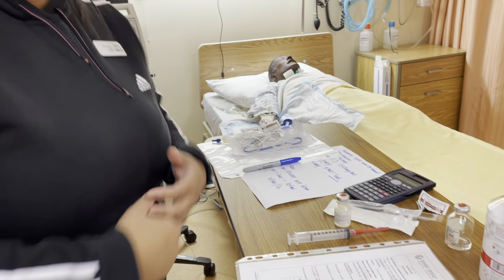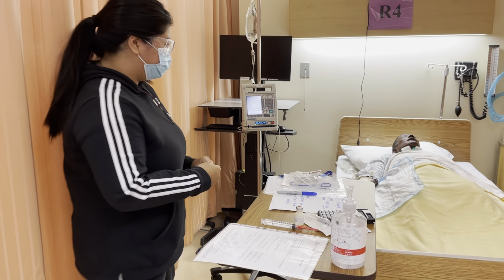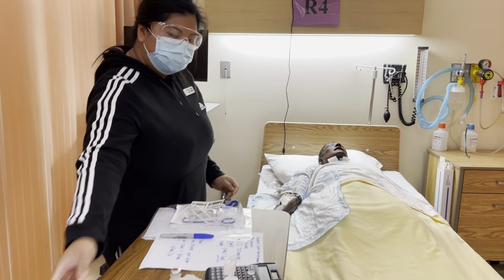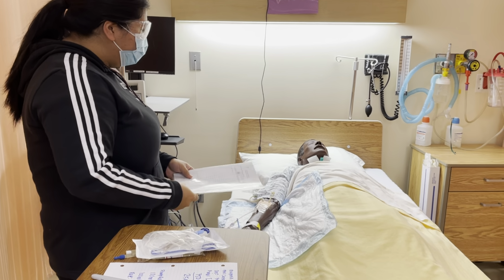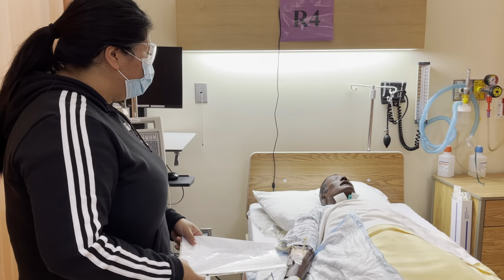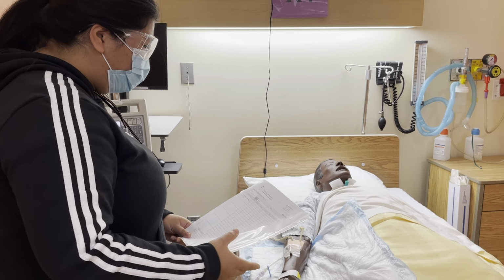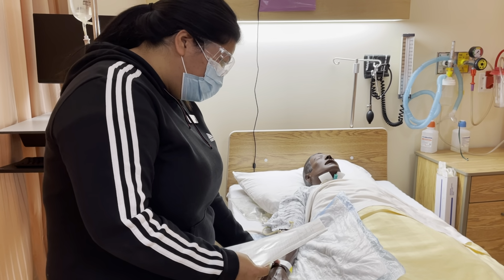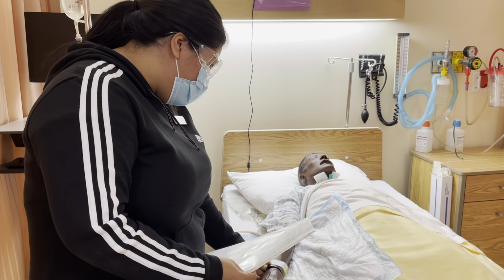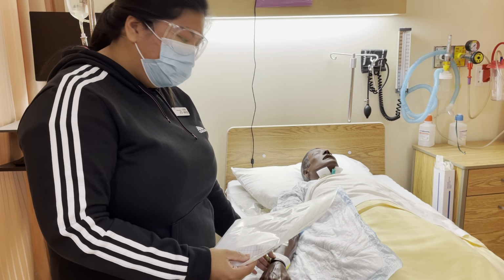So then when I enter my patient's room, I'm going to do hand hygiene and introduce myself. Hi there, my name is Alex Cruz. I'm a Year 3 student nurse at the University of Manitoba. I'm here to administer your medication today. Can you please tell me your name and date of birth? Shredder Shane. And I'm also checking the FIN number, making sure that they match.